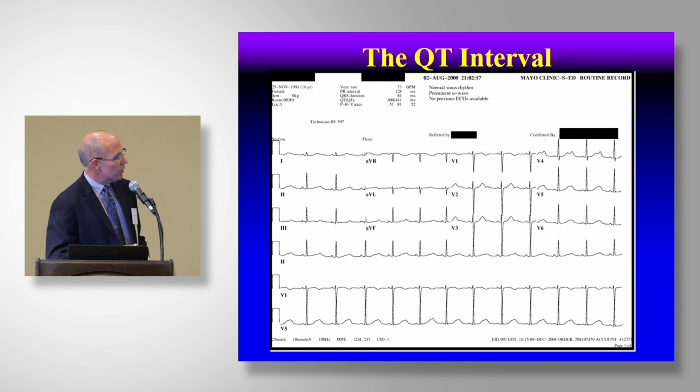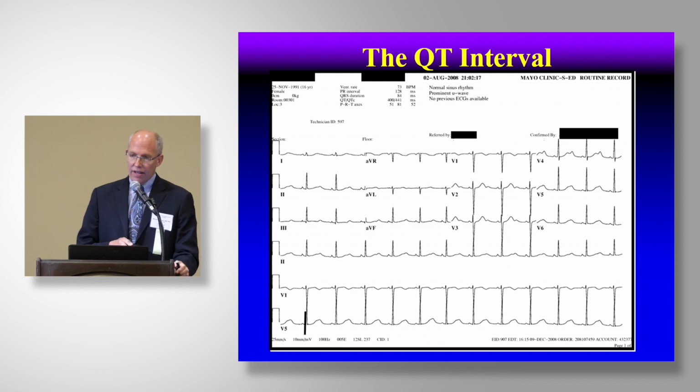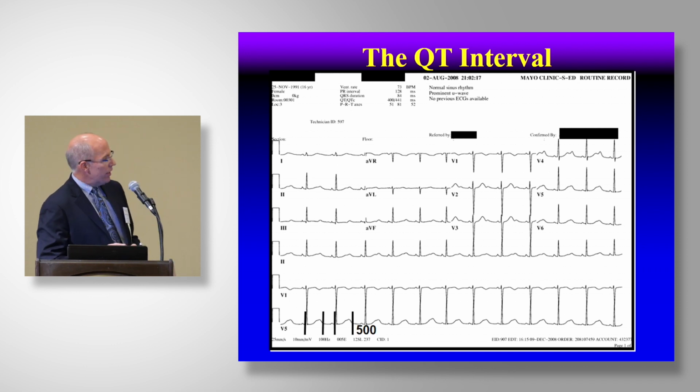And here was the consequence in our institution of this abysmal failure, because it could have been different. Look, had they done what we talked about in our last 15 minutes, eyeballed the QT, put it in your eye or your calculator, and then said, wait a second, I'm getting 500. What's going on here? Why is the computer getting 400?